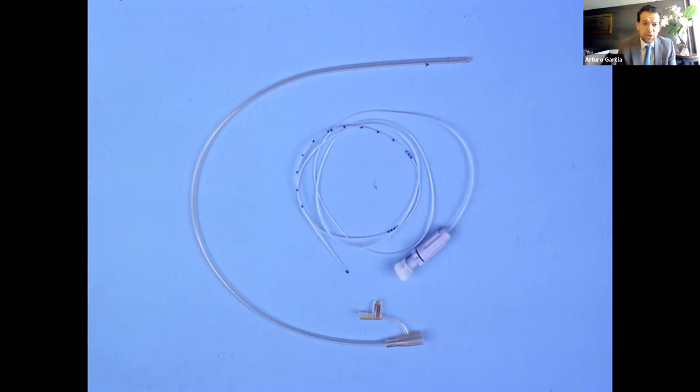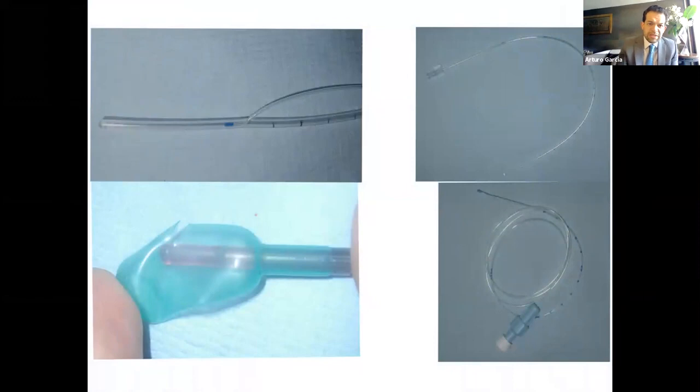But if you don't have this, or it's more convenient for you to do the dual lumen catheter, then it's okay. You always have to use the smallest dual lumen catheter you can. Try to get a 6 or 7 French. This is going to be the most useful thing. Over 8 French, it is not recommended because it is going to interfere with the measurement in pressure flow studies. So this is the way you feed the catheter inside the UPP line. And after you get into the bladder, then you dislodge this from the rest of the catheter and you can carry on with the test.